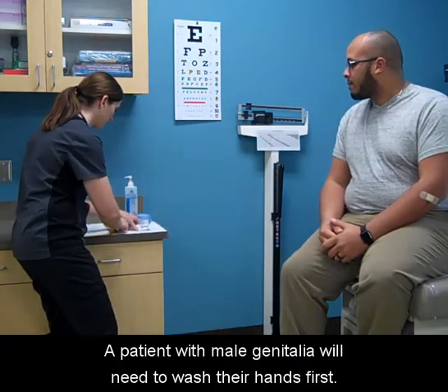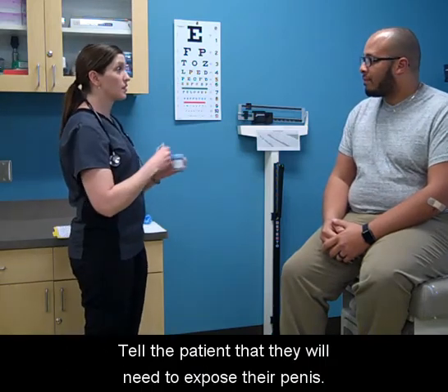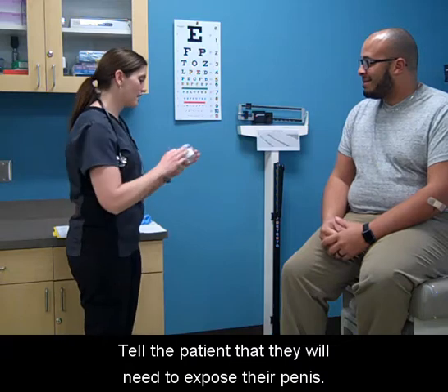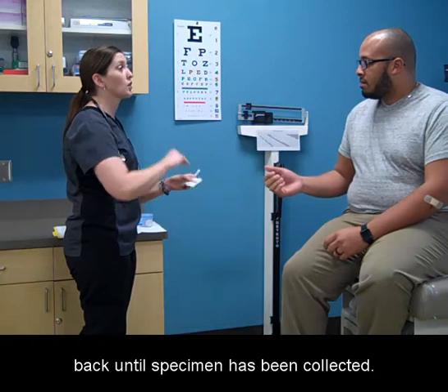A patient with male genitalia will need to wash their hands first. Tell the patient that they will need to expose their penis. If uncircumcised, pull the foreskin back and hold back until the specimen has been collected.